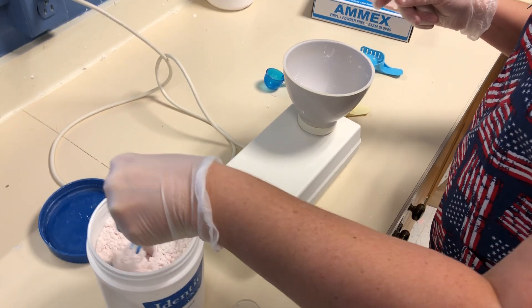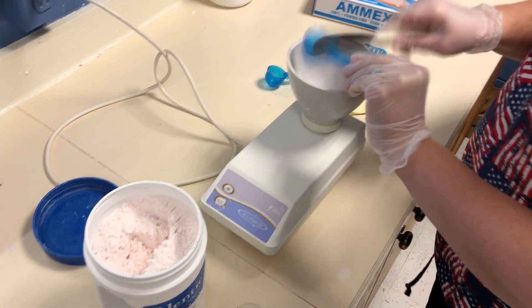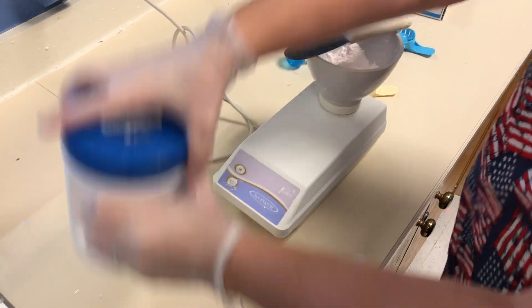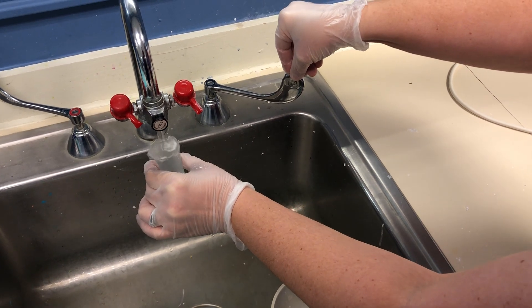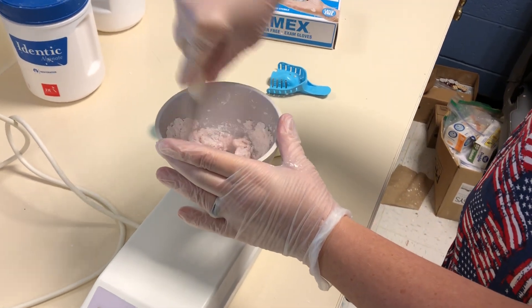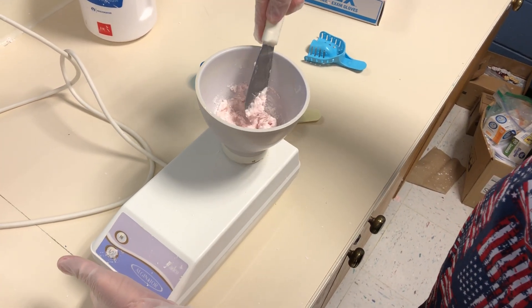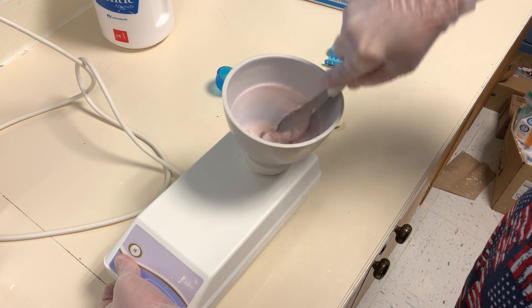I'm gonna take a lower impression. This is a heaping scoop — I'm gonna get an even measure: one, two, three. Put the lid back on, get the water, pour it in there, mix it up a little bit. Wipe the spatula off, hold it on low pointing it down — if you point it up it's gonna splash up on you — so point it down and push into the bowl with an overhanded grip.